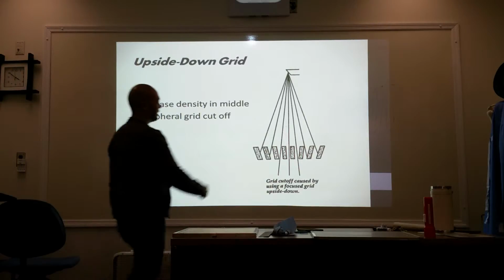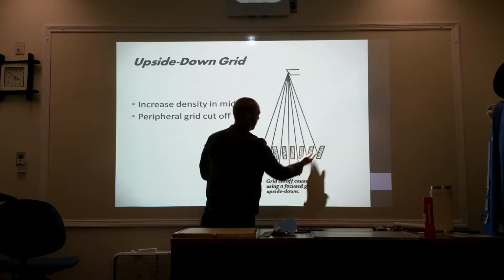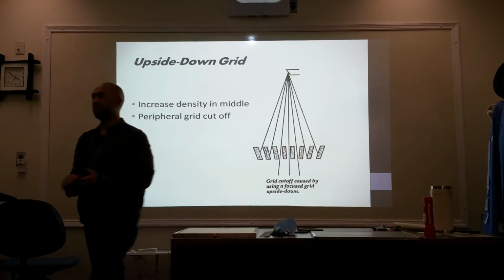Okay? Notice that the slant is going the other way. It doesn't match the divergence of the beam.